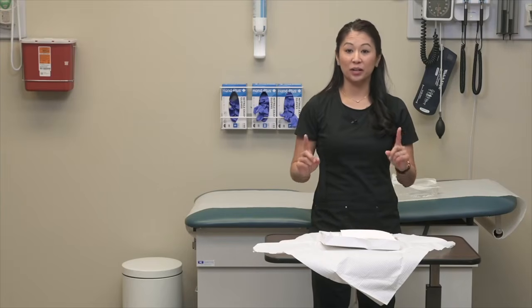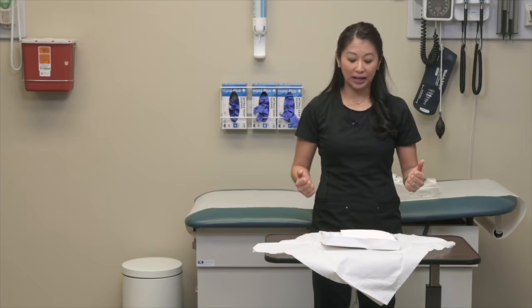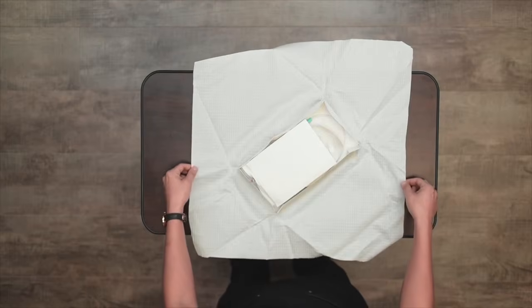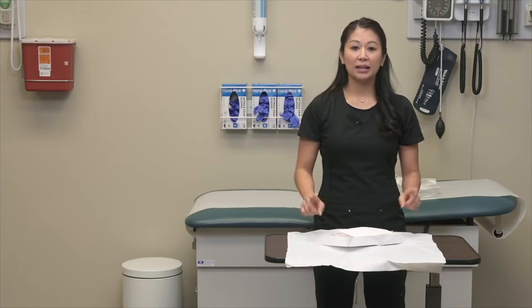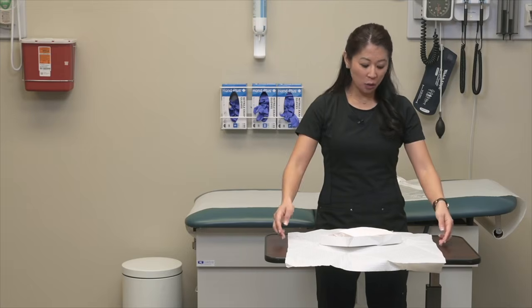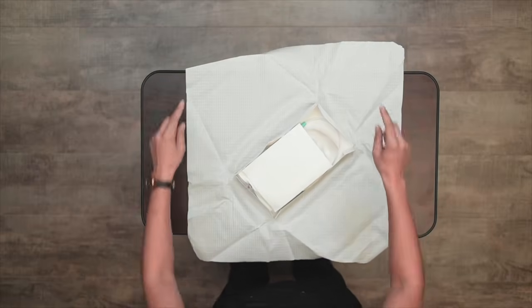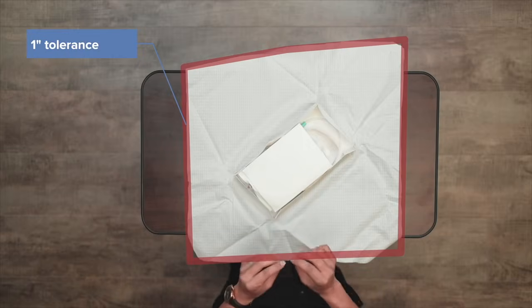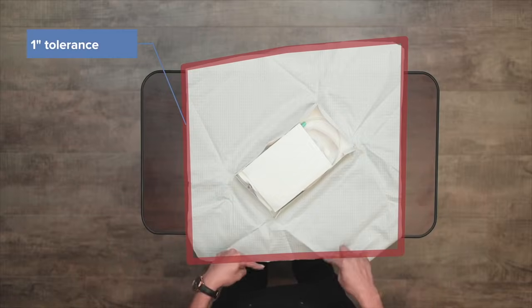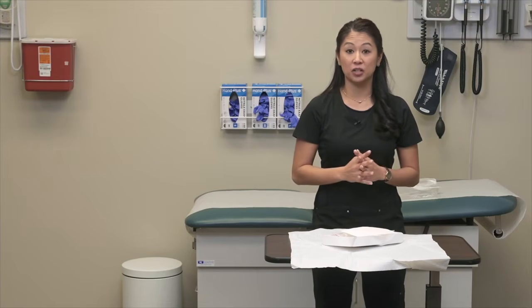So now this is open, a trick I want to show you. It's really important that we have this in the way that we can perform our patient care. This isn't ideal, so I can take the edges and move this appropriately or move it side to side. Now, a really important concept with sterile field. Well, there's a few. First one is, notice you saw me touch that and you're thinking, I thought you weren't supposed to do that. But you have a 1-inch border on a sterile field that is acceptable to touch. So again, you have a 1-inch border around the sterile field that is not considered sterile, and we can use this to move our package if need be.